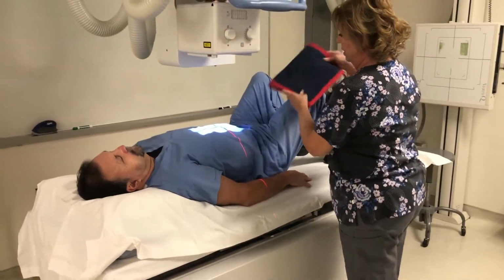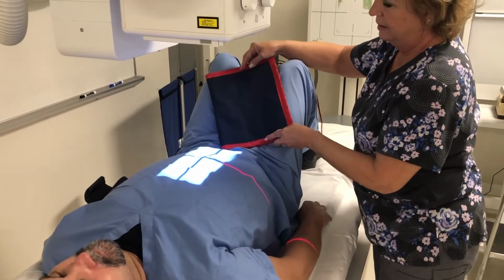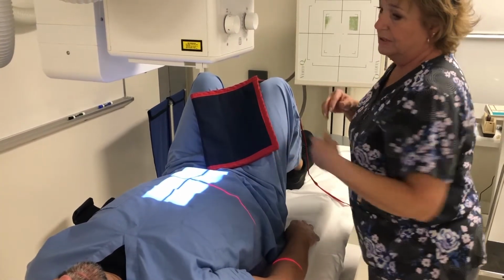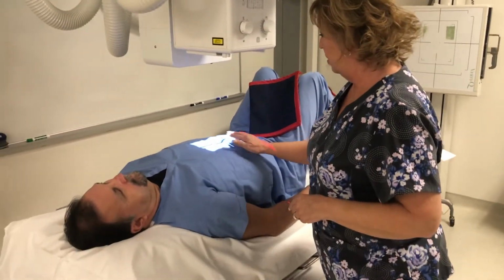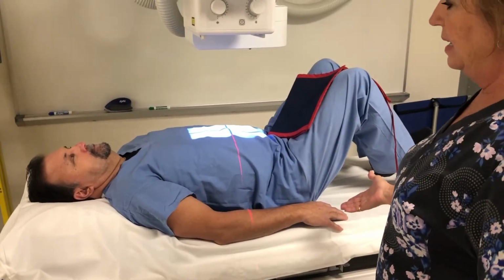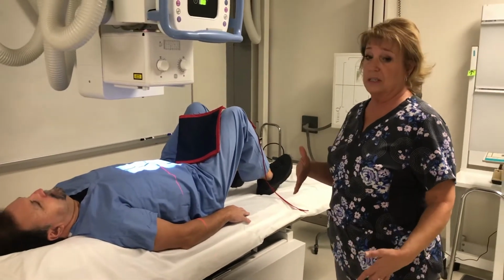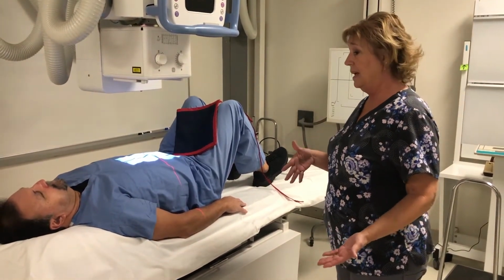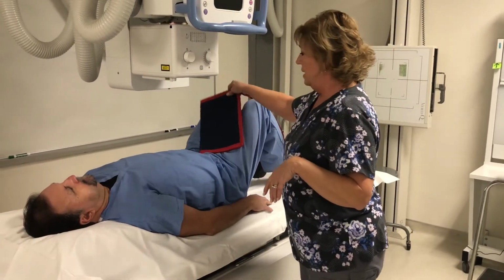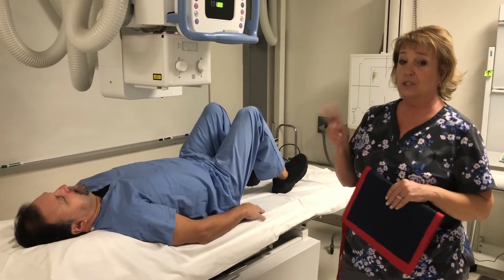I am able to shield a male patient, so I'm going to go ahead and put the shield here. You can keep your legs bent. Okay. It's outside of the field of view, but I've shielded the gonads, mid-sagittal plane. His arms can either remain up on his chest or down at his side, and this is just on suspended respiration. So I'd have you stop breathing, and expose.